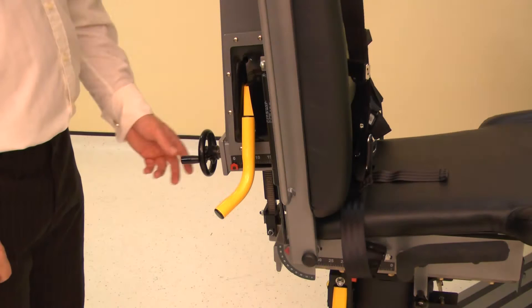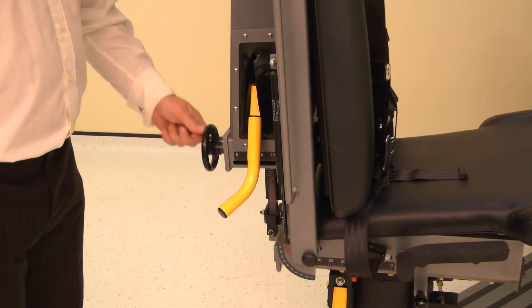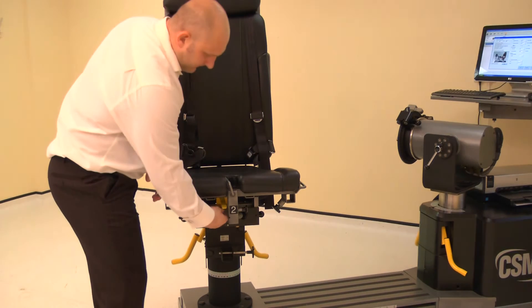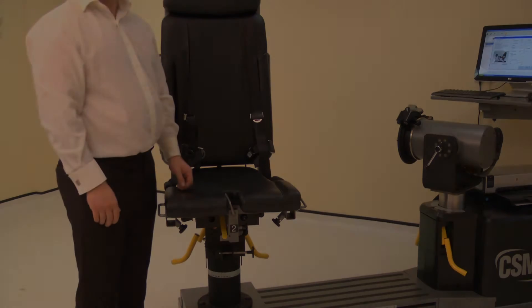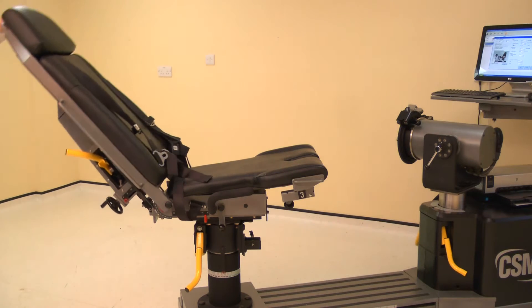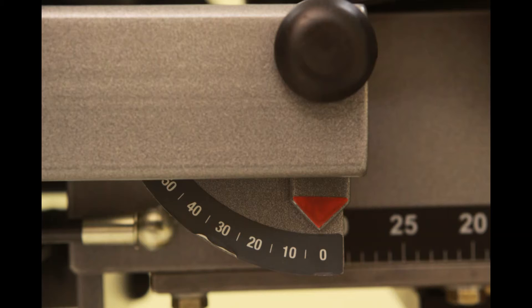Set the chair back translation by winding the handle. Adjust the chair back translation to position 0. Set the seat to the down position by lifting the seat and releasing the lock. To set the chair back angle, lift a locking handle and adjust the chair back angle to 0 degrees.